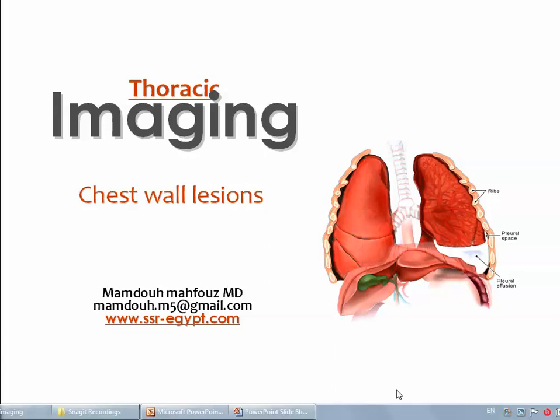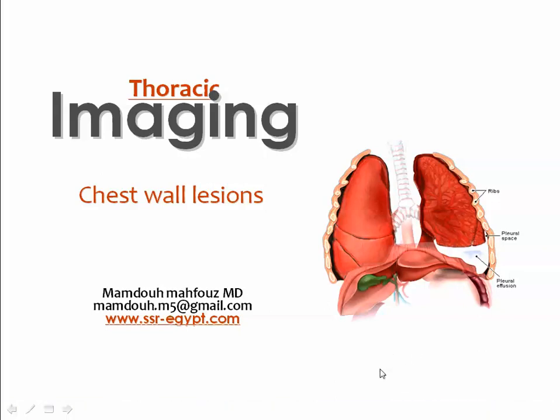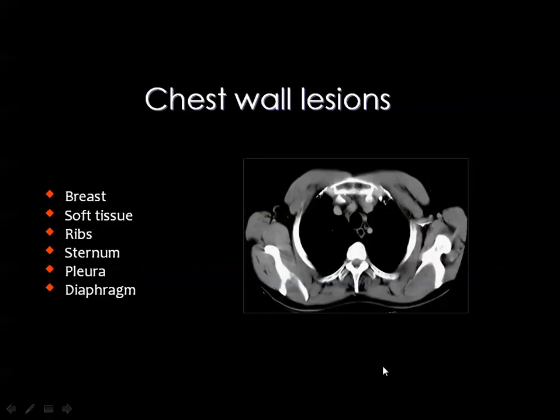Dear colleagues, this is almost the last lecture in the sector of chest imaging, and as I have said before, this will be about the imaging of chest wall lesions. I finished the lecture before talking about the pleural lesions, and this is the second part of this topic, which deals with the pleural and chest wall lesions together.